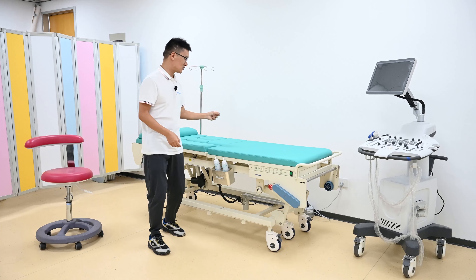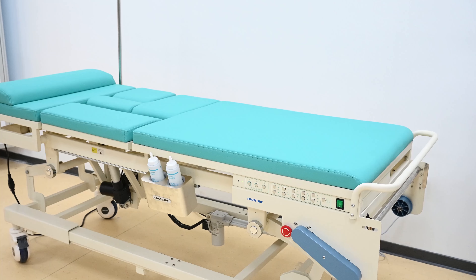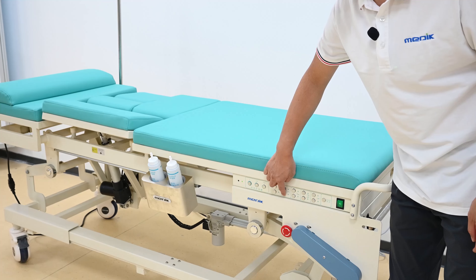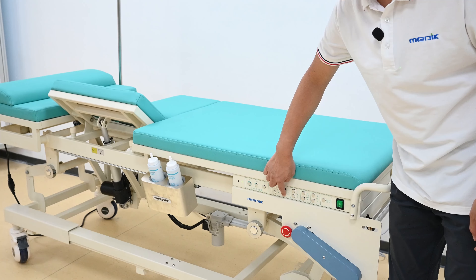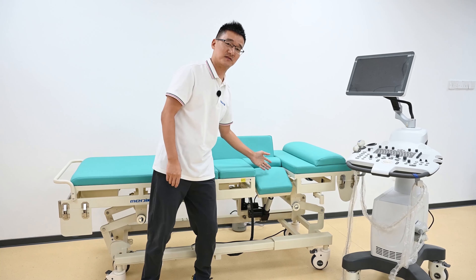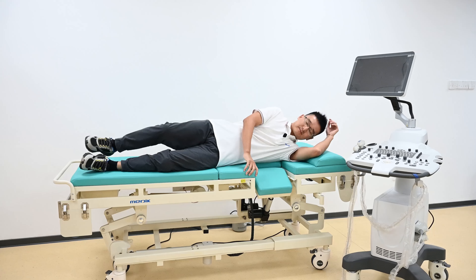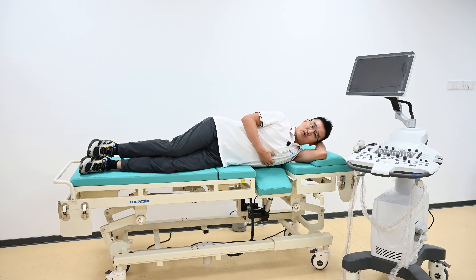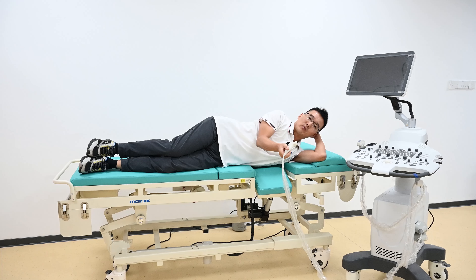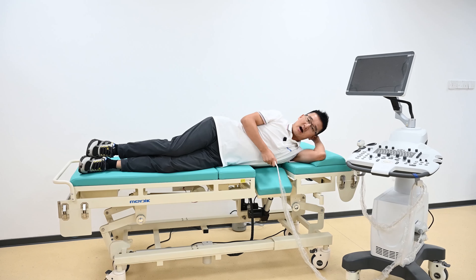When the doctor is doing diagnosis, he doesn't have to move the chair — just push the button. Let's start operating the cardiac diagnosis position. After the operation, we get a position structure where the patient will lie down with the heart exposed and with open space. The doctor can then use the heart probe with free movement to get a proper image for the heart diagnosis.